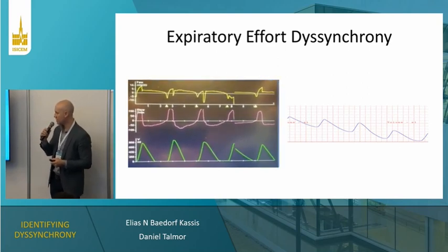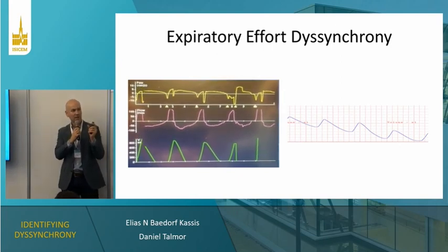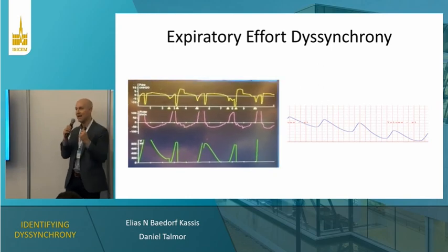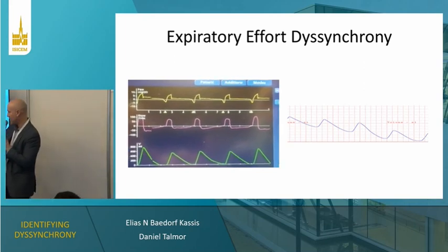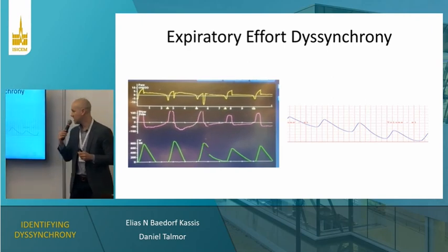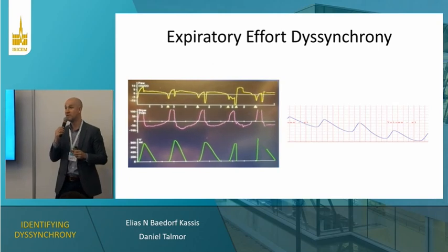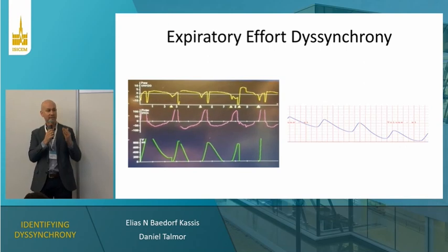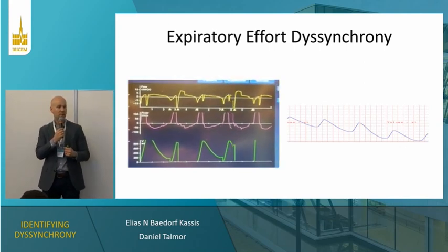And so what we're showing here is that expiratory efforts are not always just terminating the breath. They're also sometimes even more concerning, where the patient is bearing down against the ventilator over a longer period of time. If I look on the ventilator here in the bottom tracing on the left, you can see that the volume dips down to 0, and then you don't see it extend any further. Why that's happening is the ventilator is re-zeroing again. So you're missing the fact on the ventilator that the patient is actually exhaling to a much lower total lung volume by bearing down because of that re-zeroing effect.